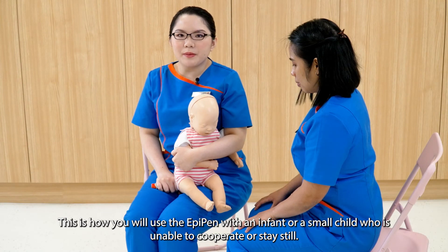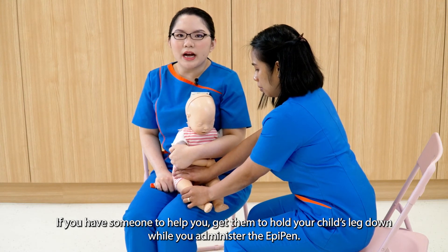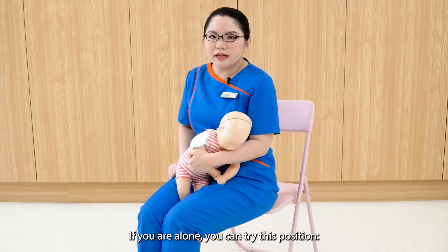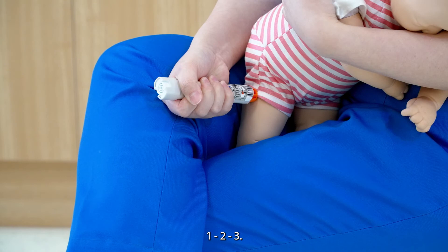This is how you use the EpiPen with an infant or a small child who is unable to cooperate or stay still. If you have someone to help, get them to hold your child's leg down while you administer the EpiPen. If you are alone, you can try this position: restrain your child's leg firmly and inject the EpiPen — one, two, three.